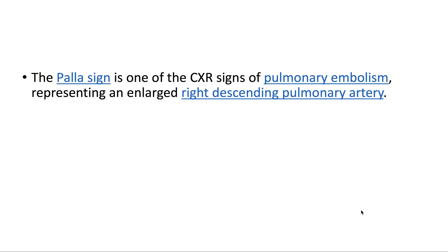Palla's sign is one of the chest x-ray signs of pulmonary embolism, representing an enlarged right descending pulmonary artery. On CTA, we have 3.